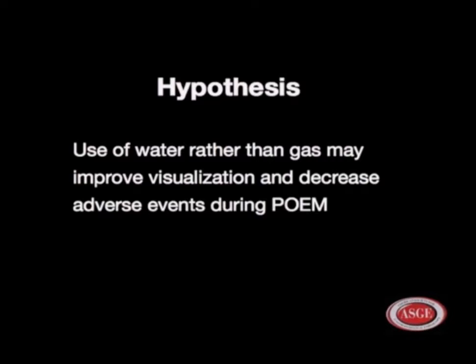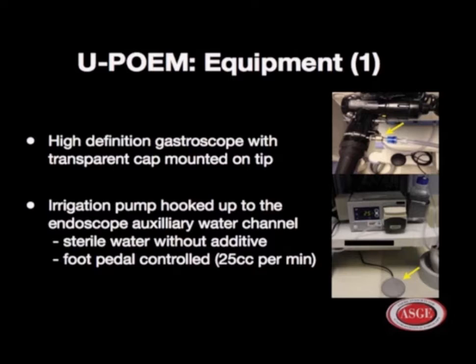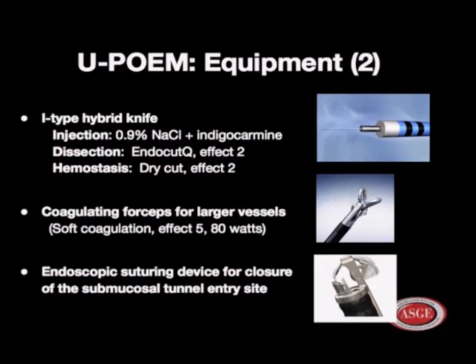We used a high-definition gastroscope with transparent cap. We used an irrigation pump hooked up to the endoscope auxiliary water channel. We used sterile water without additive, and a foot pedal to control the infusion at 25 cc's per minute. We used an I-type hybrid knife for injection, dissection, and hemostasis. We used coagulation forceps for larger vessels and an endoscopic suturing device for closure of the tunnel.